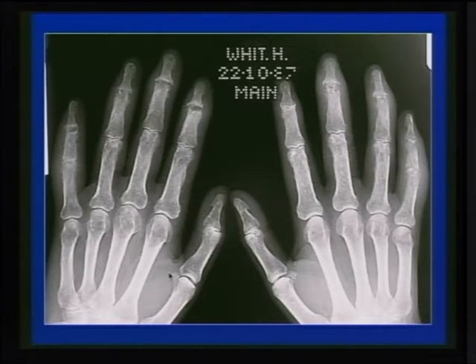Most of us, in the usual day-to-day work, will be faced with this type of examination. Sometimes we think that it is so much difficult, or not difficult, but what I mean by presenting this one is that we should have a systematic way of looking at joint x-rays. So for this case, I think everybody can see that the alignment is maintained, the bone density is slightly reduced, especially around the joints, and the joints are pseudo-widened. They are not really widened too much, but they are distracted. That's why you see them as wider than the usual adjacent joints, which are normal. Some soft tissue swelling and sausage-like digit involvement of the distal aspect, this is psoriatic arthropathy. So this is a typical presentation of psoriatic arthritis.